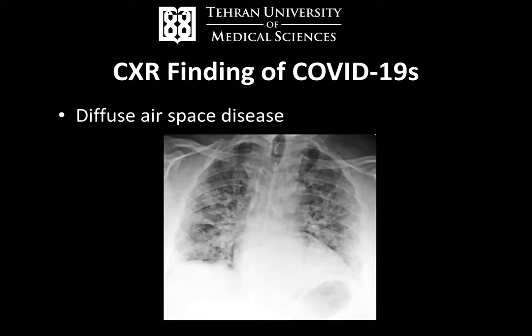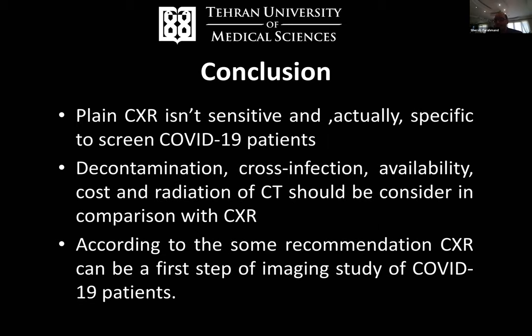Finally, I want to conclude that plain chest X-ray is not sensitive and not specific to screen and confirm the diagnosis of COVID. But because of decontamination issues, cross-infection, availability of CT scan, cost, and radiation, maybe it's not logical to use CT scan for every person, every suspicious case.